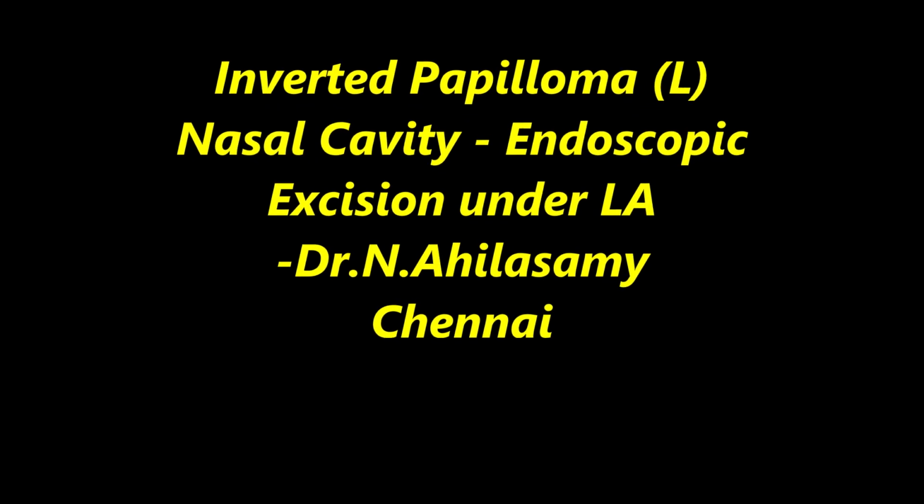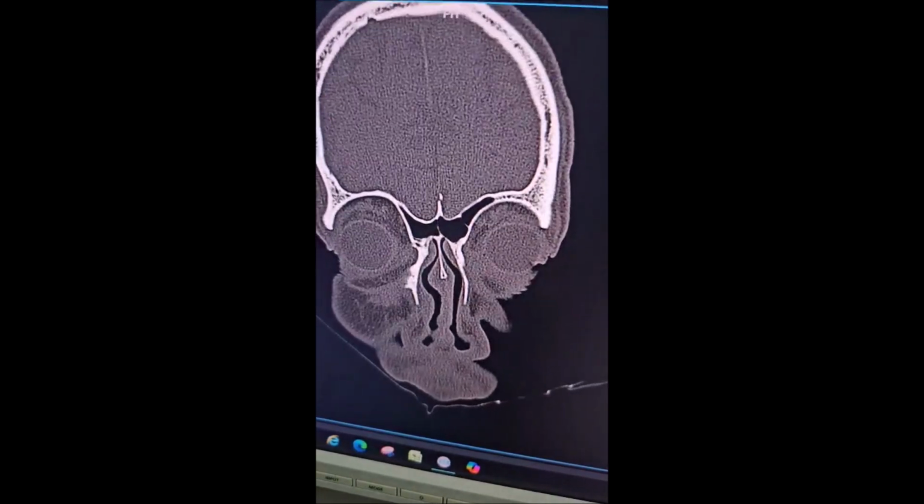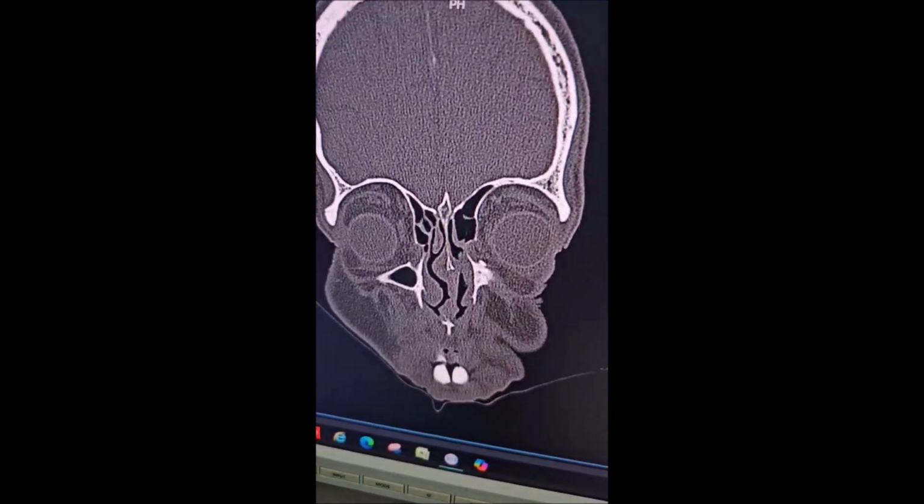I am going to show an interesting case of inverted papilloma of the left nasal cavity, endoscopic excision under local anesthesia. This is a 79-year-old male patient presented with nasal block. You can see the coronal CT scan image.